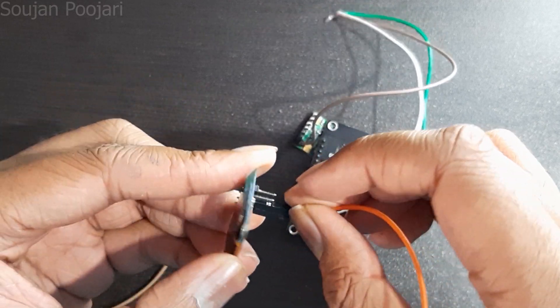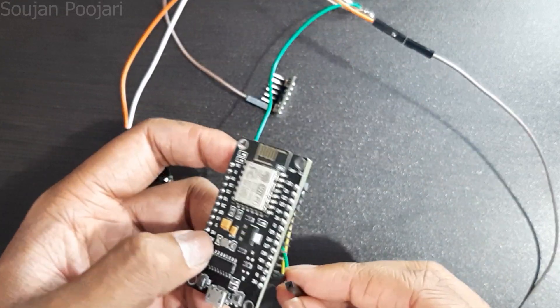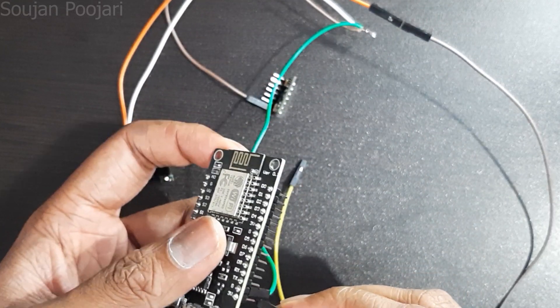In the same way, connect all the grounds — that is, ground of MAX30100 and ground of the display — to the ground of NodeMCU.